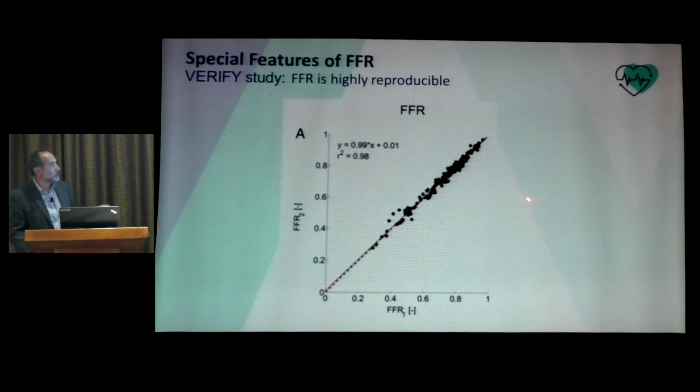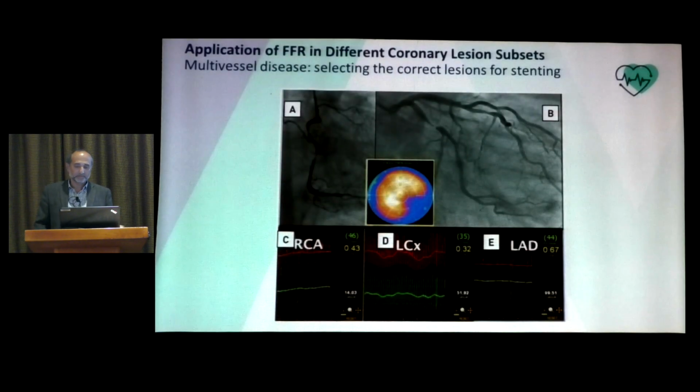Now, one of the good features of FFR is that it's reproducible. You do it on a vessel in a patient. If you want to repeat it again, you will get exactly the same result. So it's very reliable in the same vessel in the same patient.